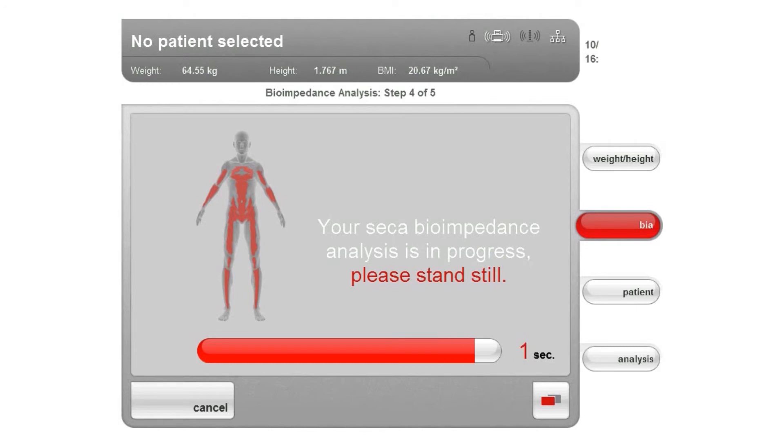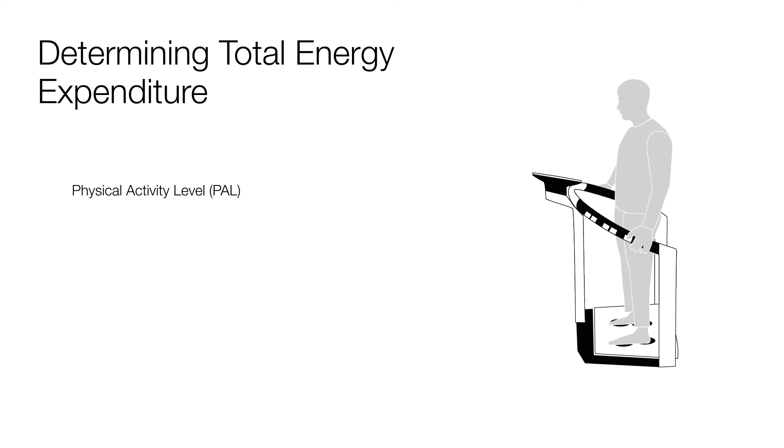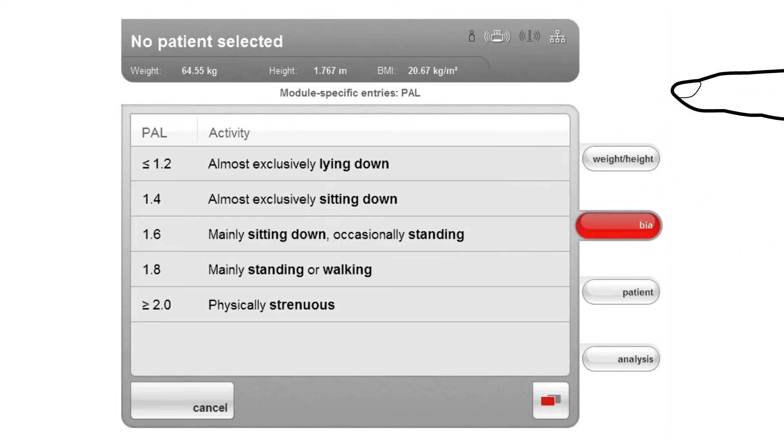You can immediately view the results in the software and use them to diagnose your patient. When the bioimpedance measurement is completed, the dialog box for the module-specific inputs appears. First, you will be asked to enter the PAL value. PAL stands for Physical Activity Level. If the energy module has not been selected for measurement, the input of the PAL value is not necessary and will be skipped. The PAL value is multiplied by the energy output at rest to determine the total energy expenditure of the test subject, which is generated in the evaluation module Energy. The typical PAL values include 1.4 for an inactive person who performs almost exclusively sedentary activities.